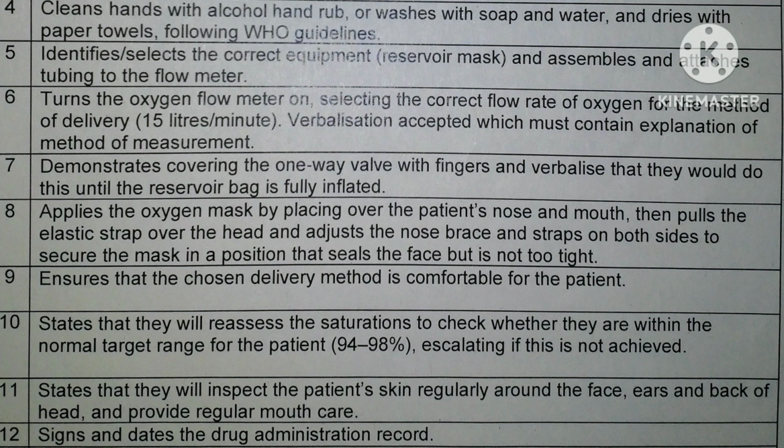Nowadays they are providing all equipment arranged on it like that. So you can connect the oxygen and tubing to the flow meter. Then don't forget to turn on the oxygen and select the correct flow rate.